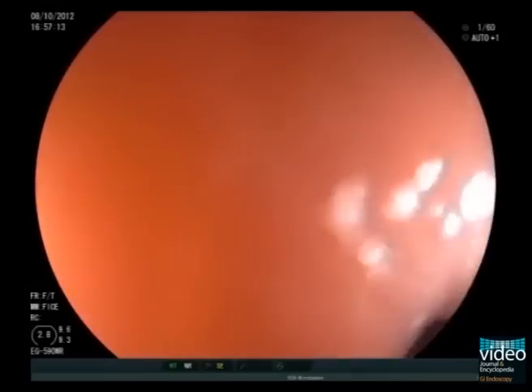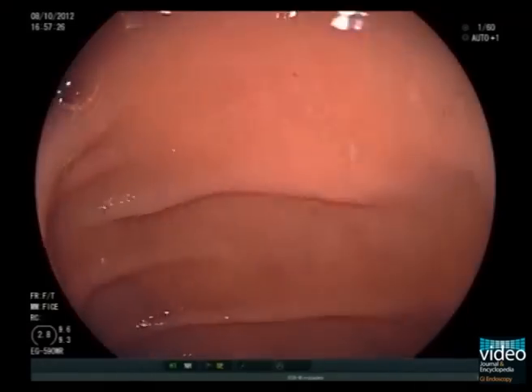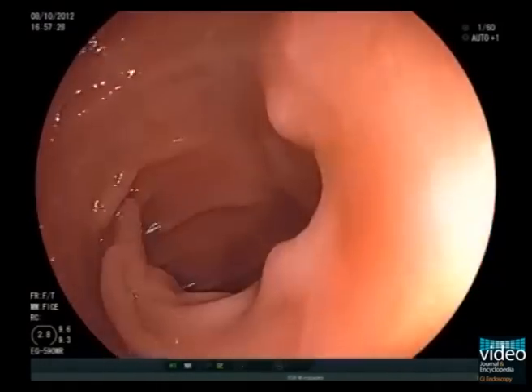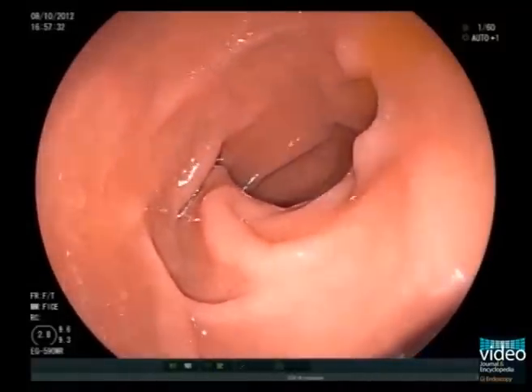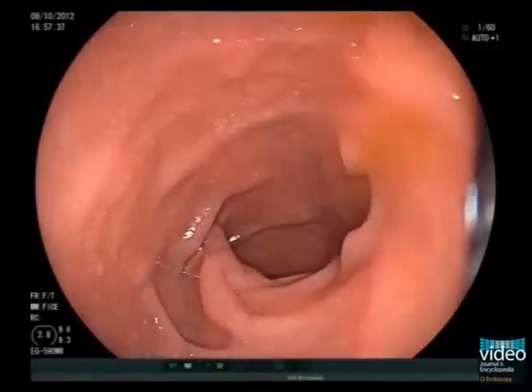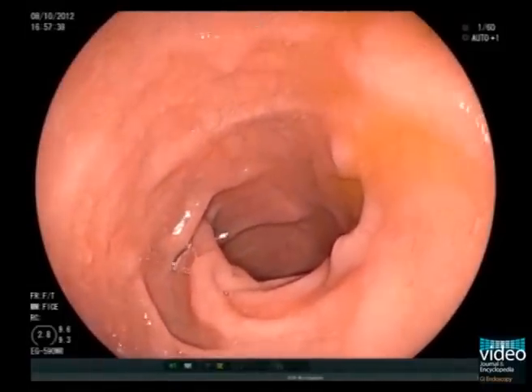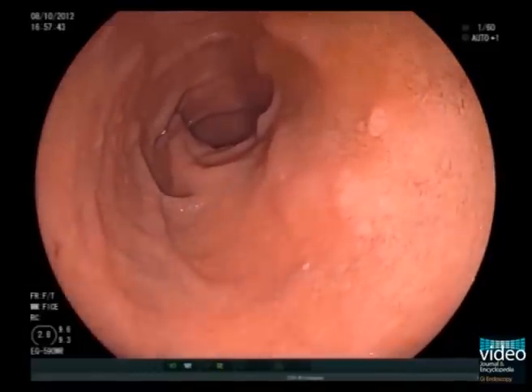At this stage the patient may experience a little discomfort. Successful intubation results in a red-out appearance due to the tip of the instrument being applied closely to the mucosa of the anterior wall of the bulb. After the proximal bulb has been entered by the pyloric channel, stop and wait until sufficient air has been given to inflate the bulb. Inspection of the bulb is carried out using advancing and withdrawing movements. At this stage the scope may often return into the gastric cavity.